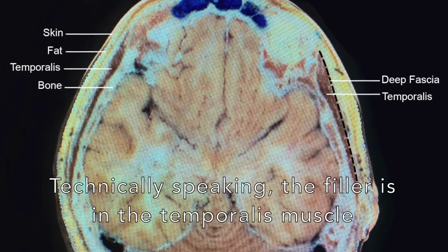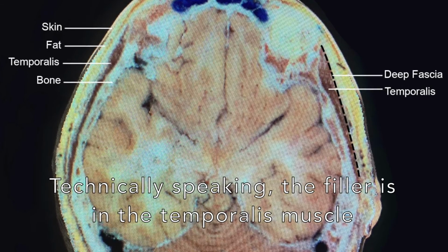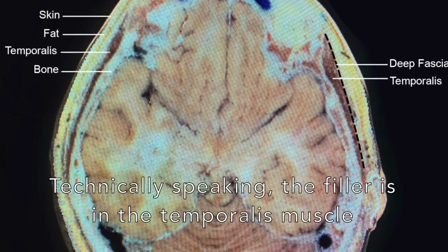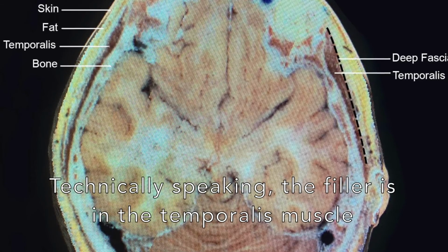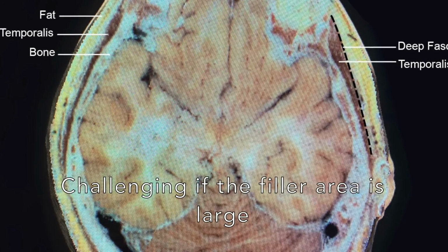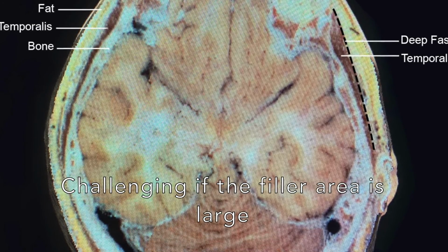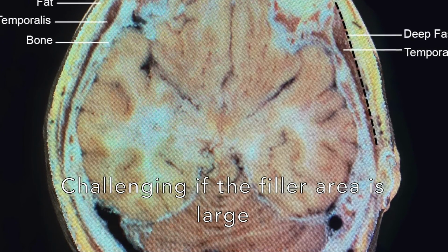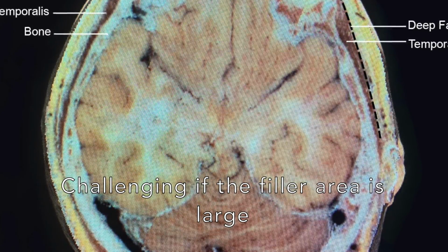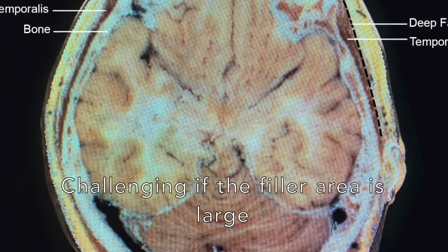Once the filler is placed, then it is massaged into place. The filler can only move along the muscle itself, as it cannot lift the muscle off the bone. This could be a challenge if a large amount of filler is required to fill this area. In patients with severe hollow, this may not be possible.